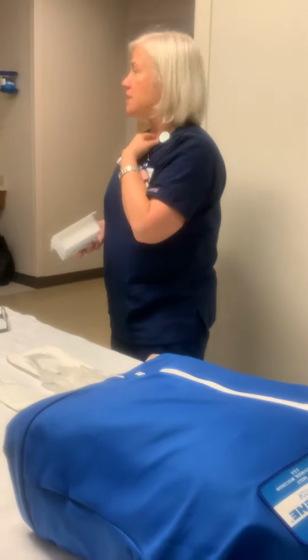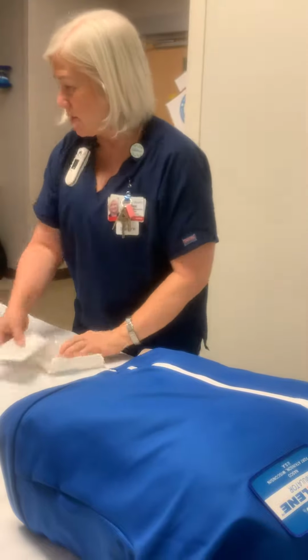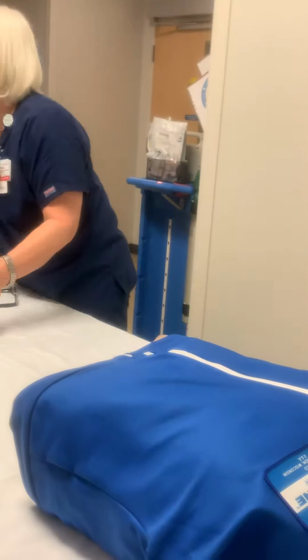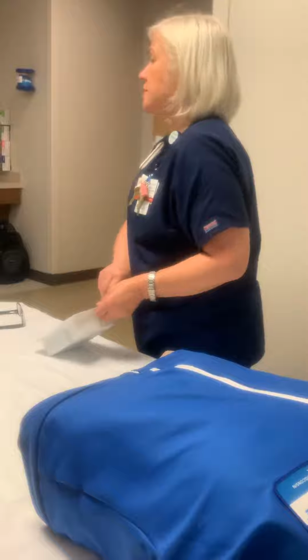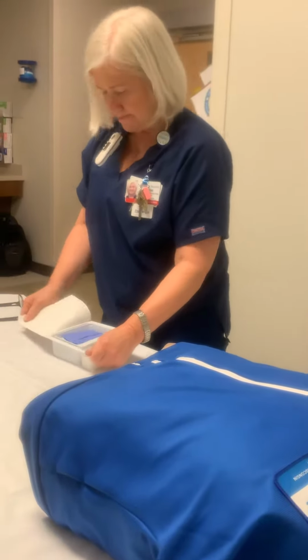Remember, you want to keep those crusts out of there, because they could flip over into there, and then they can get pneumonia. And then you've got a lot of other problems. Do we ever use peroxide anymore? No, peroxide is not used. We want to use regular saline.